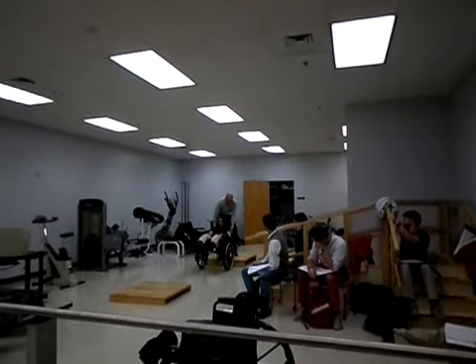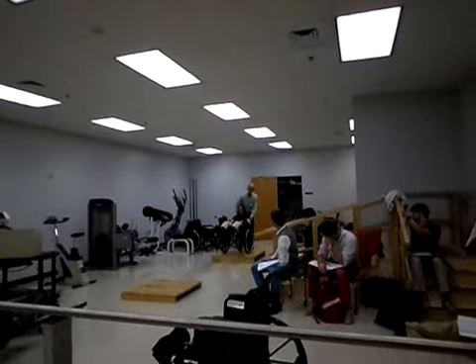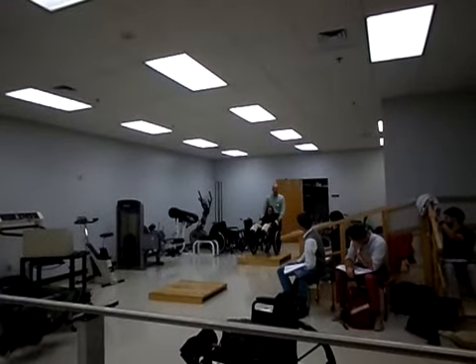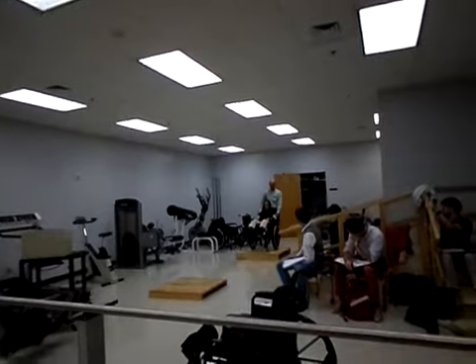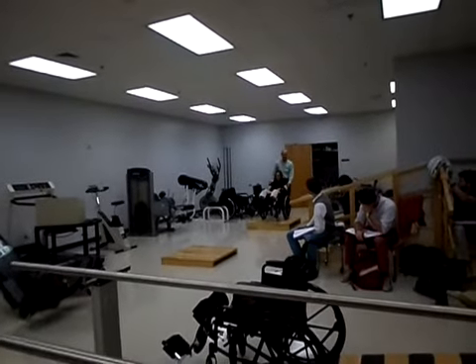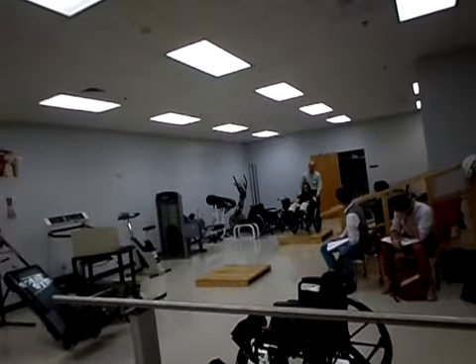Right up. Pull her up. All right. I was able to do it. What if I can't do it though? Which I'm going to do in just a minute. Okay? I'm going to take her down forward now, which is the more difficult way. It's the way we do it on the steps.